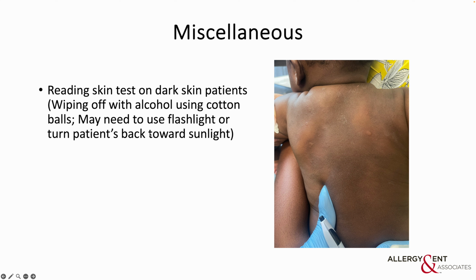You may need to use a flashlight or turn the patient back toward the sunlight so you can see the redness better. So again, this is a positive control with 5 millimeter wheal, and you got the redness around this. Okay.